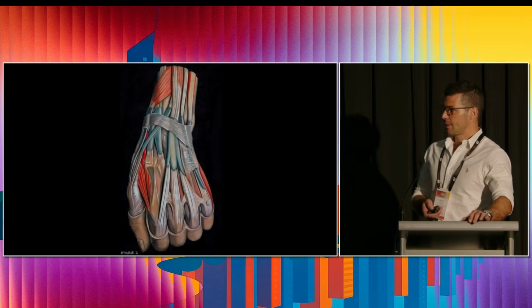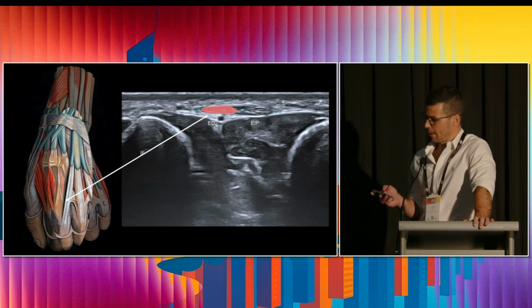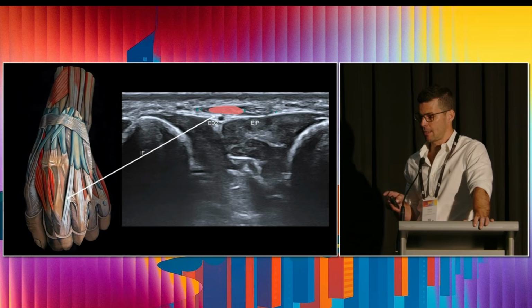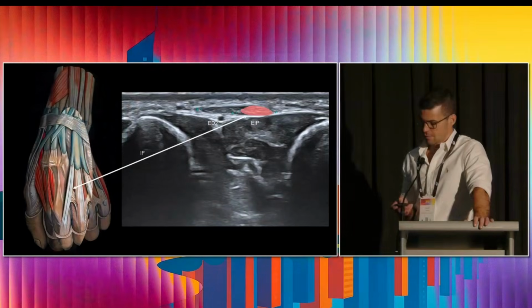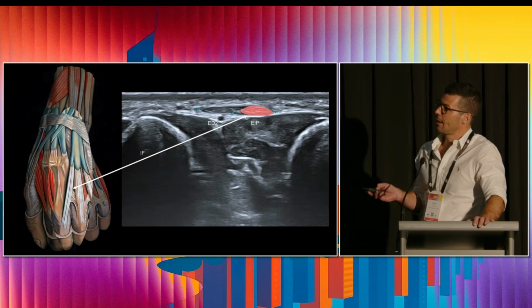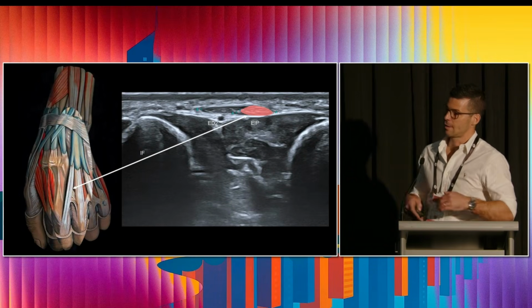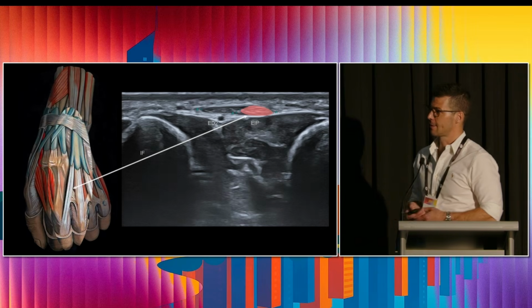And in this same location, it may not be common knowledge that there are 2 extensor tendons that run along the second metacarpal to the index finger, extensor digitorum 2 and extensor indicis. An extensor indicis is a really commonly harvested tendon for transfers and reconstructions. And in 5 out of 6 patients, it is located ulnar and deep to ED2 when you're scanning the dorsum of the hand. But in every 6th patient, that's not the case.